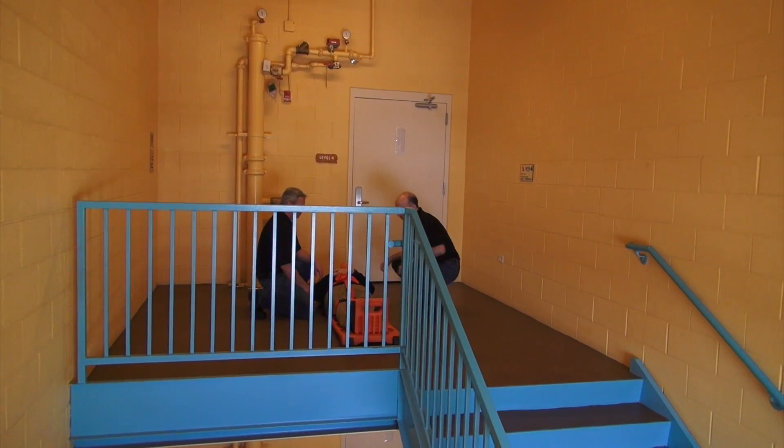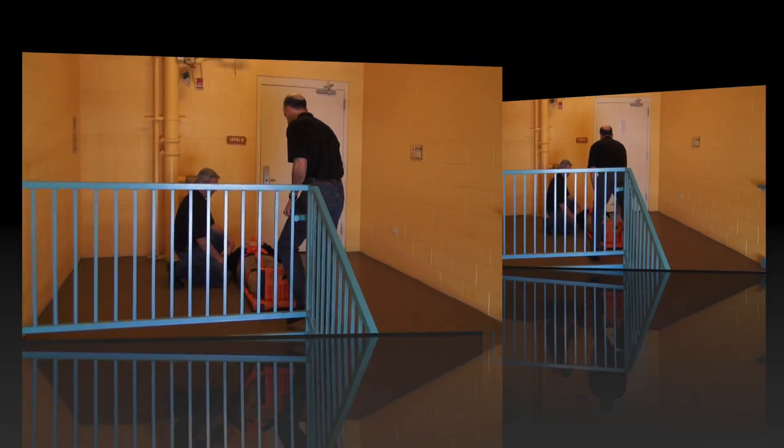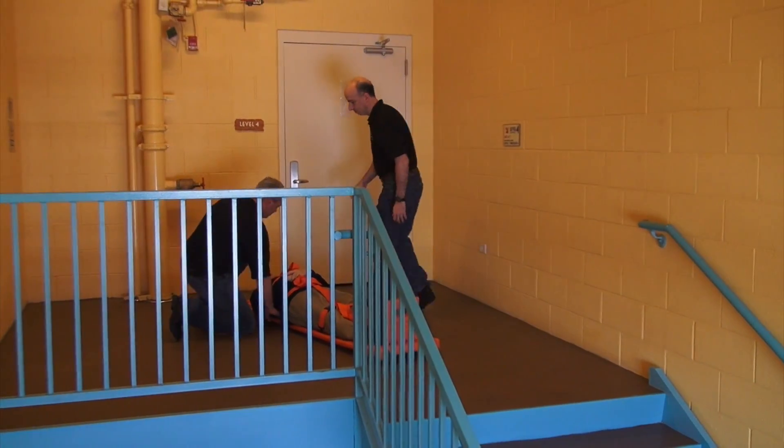Before lifting a patient, make sure the walkboard is aligned with the path you need to take. Grab the handle in the footrest and, instead of lifting, slide the wheeled end of the walkboard to your path's starting point.